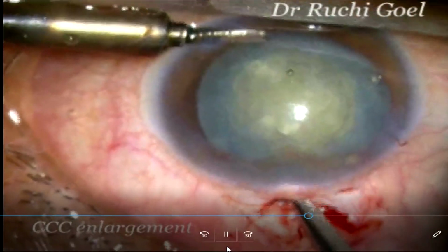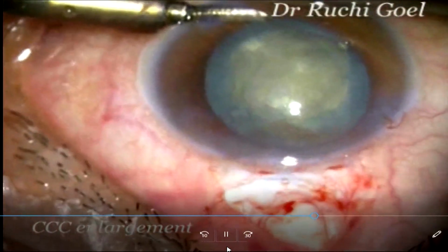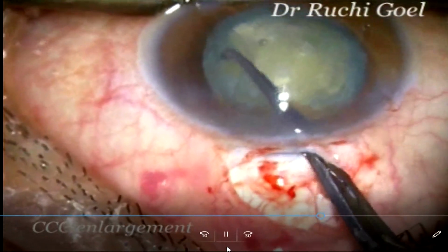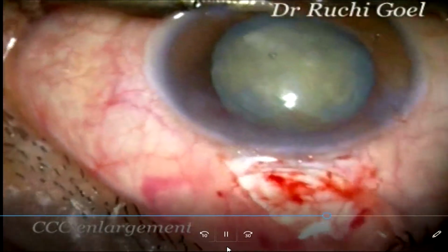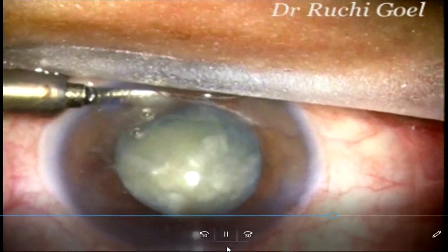Now see, this is a patient where the CCC created was smaller. This is the tangential cut I was talking about. And this is the Utrata's forceps. You can just simply enlarge it. Another cut on the other side.